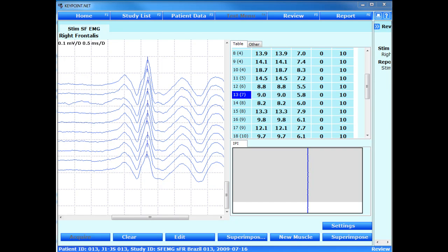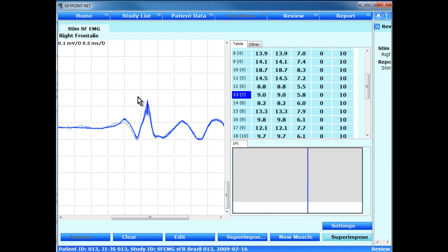This is a recording with electric stimulation of the frontalis muscle, and here you see multi-spike recordings, and the question is whether this can be acceptable. Only one is accepted by the computer, and obviously this is a complex signal. You see that it has a variable rising phase with a shoulder, and it's very clear that the shoulder also influences the peak very much. So this can actually not be used for our recordings, although the jitter is so small.